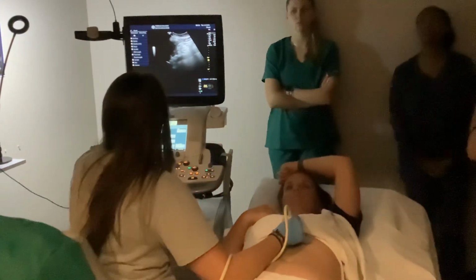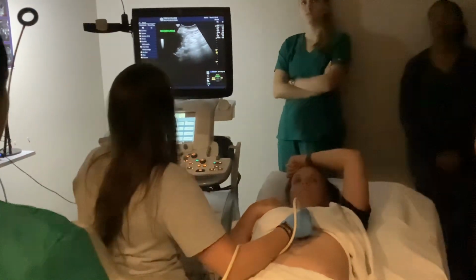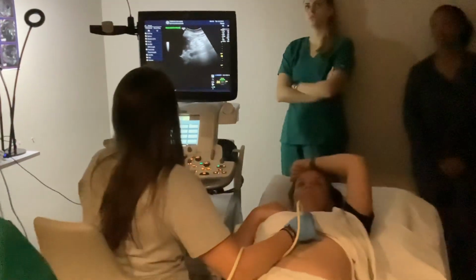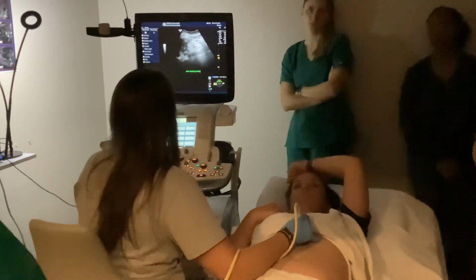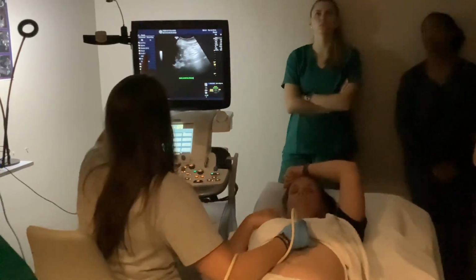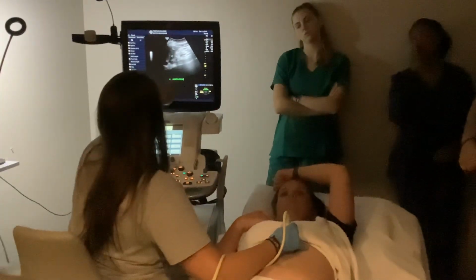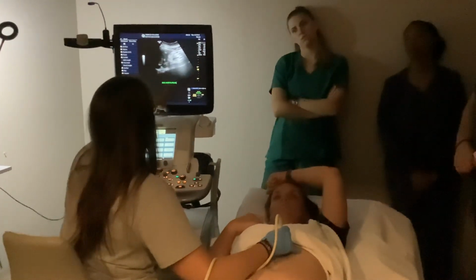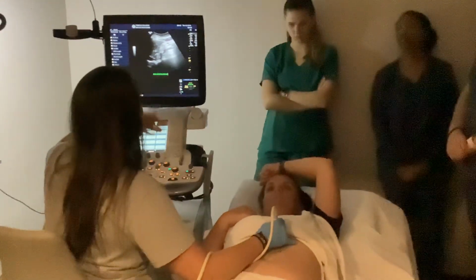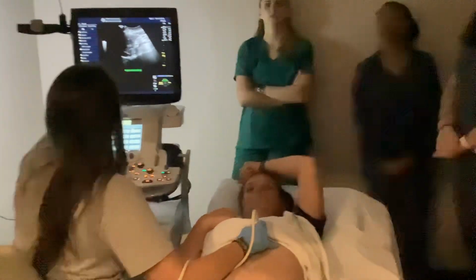Alright, so we're gonna start with long prox aorta. Did you go through labeling? We haven't gone through labeling yet. Alright, so when you annotate your image, I don't care if it's here or here, it just cannot be here, okay? You're putting the plane that you're imaging it in, which is sagittal or longitudinal, the organ that you're imaging, so we have aorta, and where on that organ that you're taking the picture. Proximal, distal, lateral, medial, okay? So we're doing sagittal aorta prox or long aorta prox.